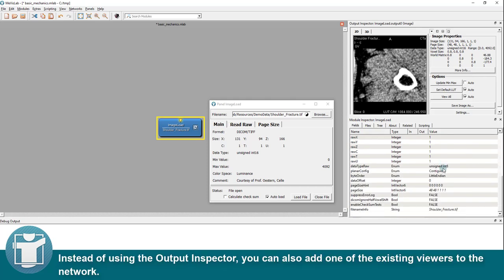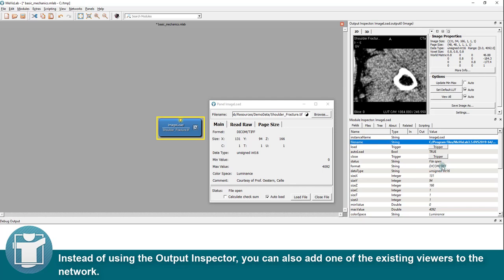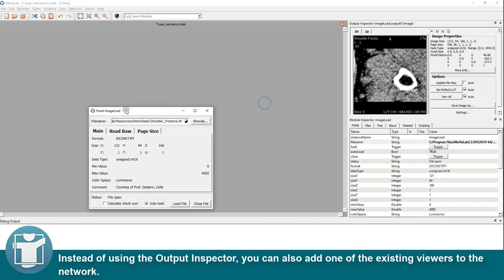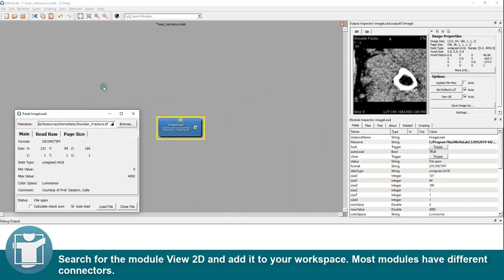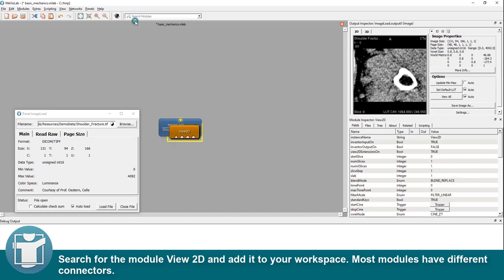Instead of using the output inspector, you can also add one of the existing viewers to the network. Search for the module view 2D and add it to your workspace. Most modules have different connectors.